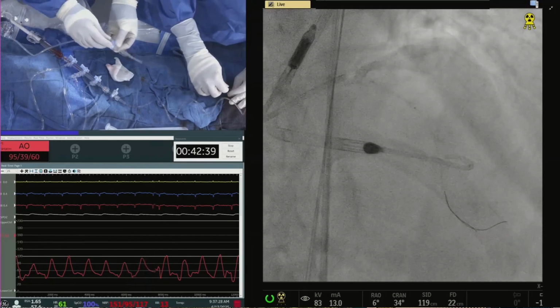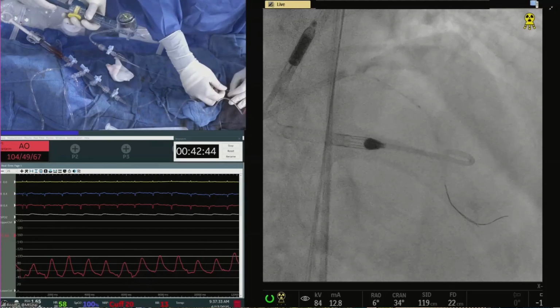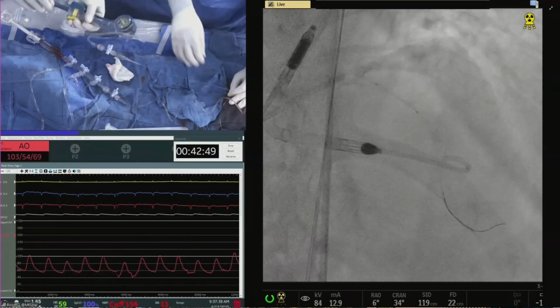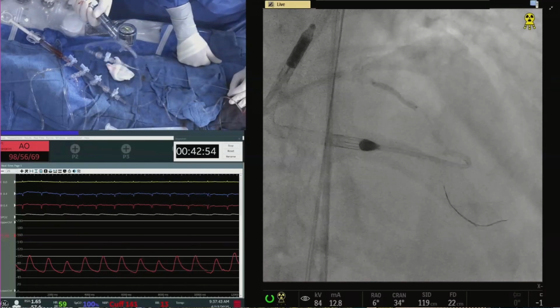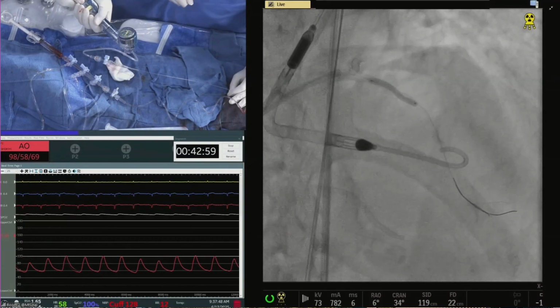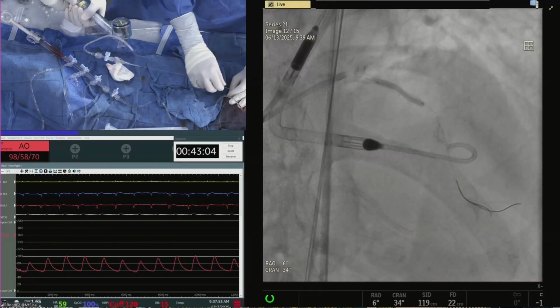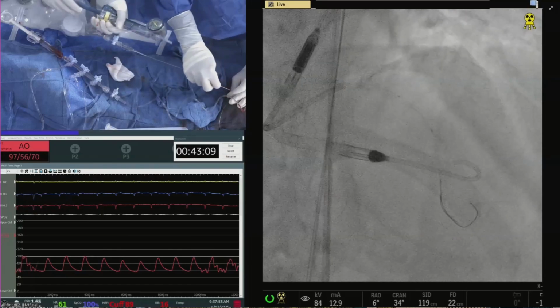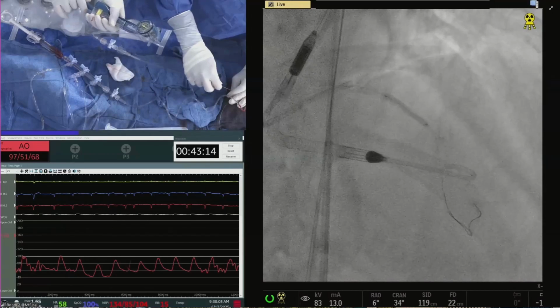Let's see now here, right? Does the balloon go down to that distal? Does it cross? Just to get an idea. I don't want to get there right now. If it dissects, then we'll be just focusing on the other. Open it, just to see if it crosses. Yielded pretty good. You may need a 2 there. Further down. I just want to know if it crosses. It's not even going. Okay, go up. It's like a fresh balloon.